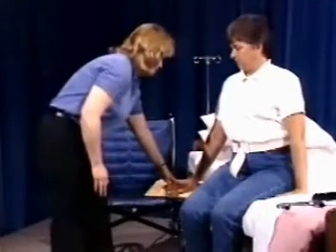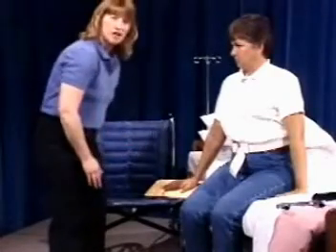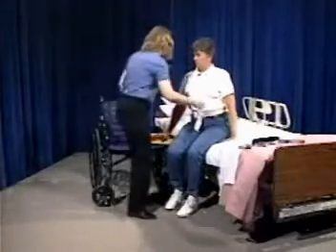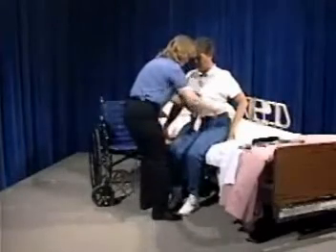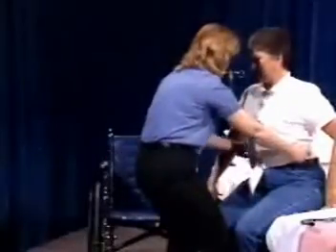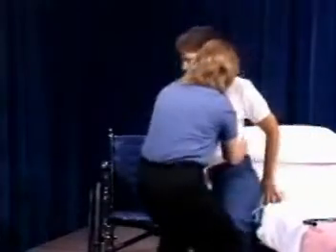Also, explain while you're doing this that as she slides into the chair, she'll need to reach for the opposite armrest to help pull herself into position. Okay, on the count of 3, I'd like to help you move into the chair. I'll help with the safety belt, and we're just going to slide into the chair, and you'll reach for the opposite arm as you get into the chair. 1, 2, 3.